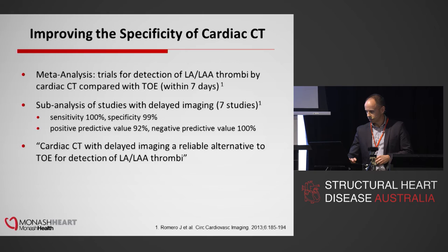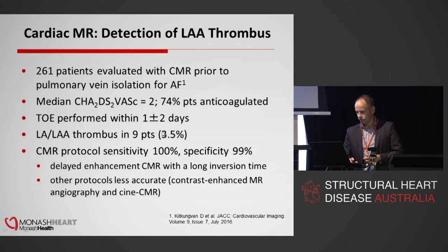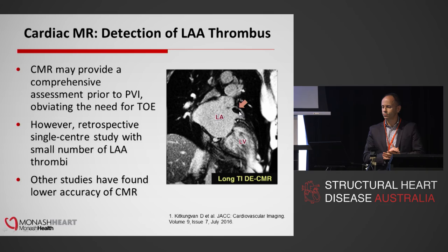CMR, on the other hand, is at an earlier stage of evaluation. This study just came online in JACC Imaging this month and is the largest study published to date, 260 patients. And they evaluated 3 different protocols, 2 of which didn't fare too well. But using this one here, this delayed enhancement CMR with a long inversion time, they got surprisingly very good correlation with TOE. And you can see the thrombus here is a filling defect in the left atrial appendage. But this was just a one centre retrospective design, and a fairly low incidence of thrombus, 3.5%, so it needs more evaluation.